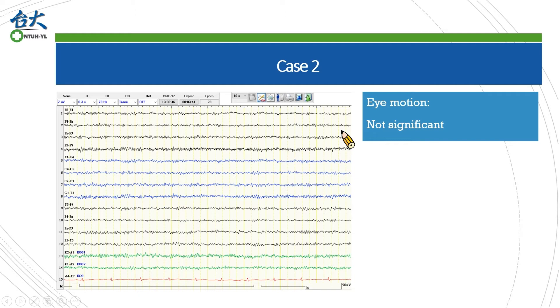So how about our case? At least I do not think our patient is drowsy. This EEG does not contain features of drowsiness as I mentioned in the previous slide. In addition, don't forget there will be slow eye movement during the drowsy state, which does not appear in this epoch. So we have two possibilities left: drug use or anxiety. Of course these two conditions are often overlaid.